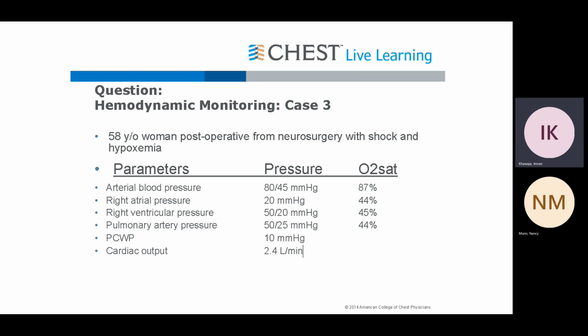Okay, so before we go to the options of the answer, what do you think? What is this profile? What is it consistent with? Just look at the whole number, don't look at just the diastolics.